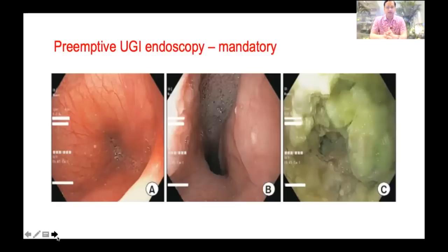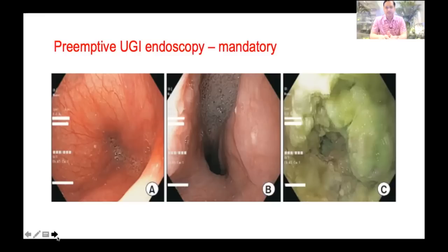Before performing POEM, we have to do endoscopy and evaluate the esophagus for three things. First, for cleanliness — in A you can see absolutely clean esophagus; in B, liquid residue in the esophagus; in C, solid debris. From A to C, the difficulty scale increases because chances of submucosal fibrosis increase as food and liquid will stagnate in the esophagus.